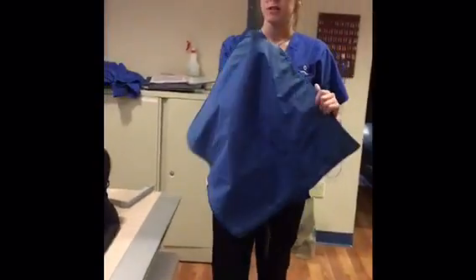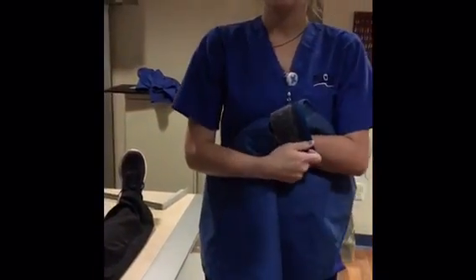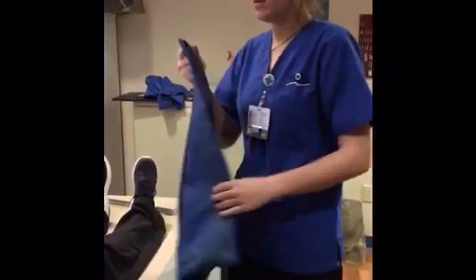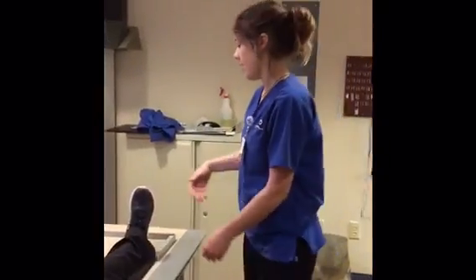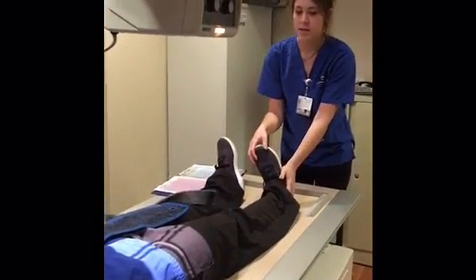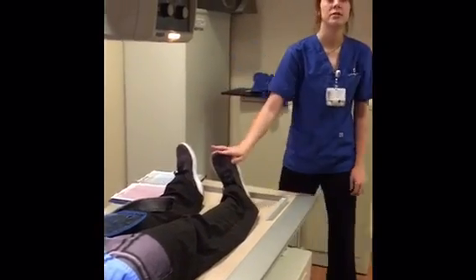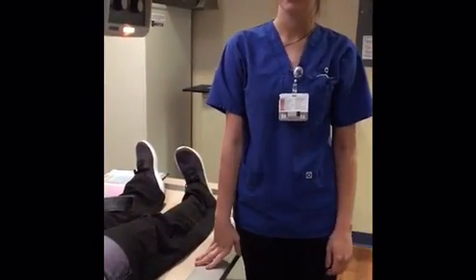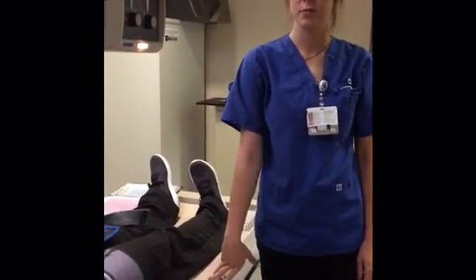Because the area of interest is the hip and we have reproductive organs inside our area of interest, I can only shield the left side of my patient. My patient is shielded. I will internally rotate her leg. This ensures that the greater trochanter of the femur is in profile, so we will not be seeing the lesser trochanter, meaning that it is superimposed over.